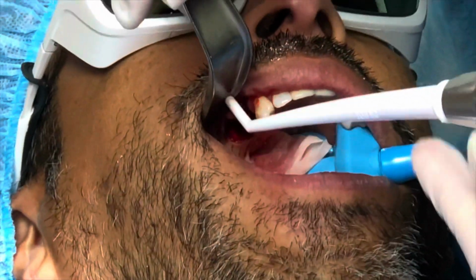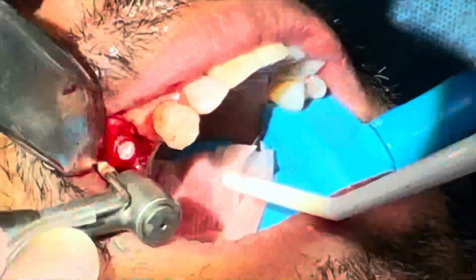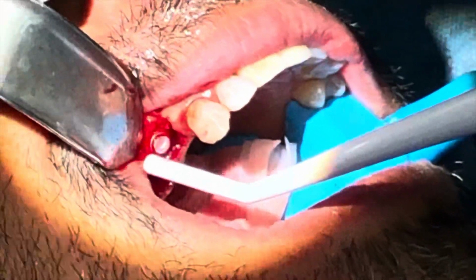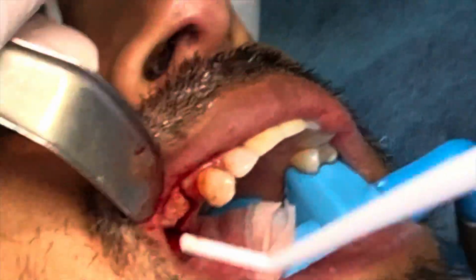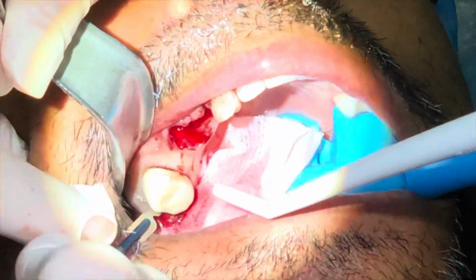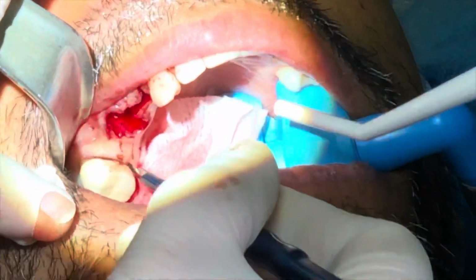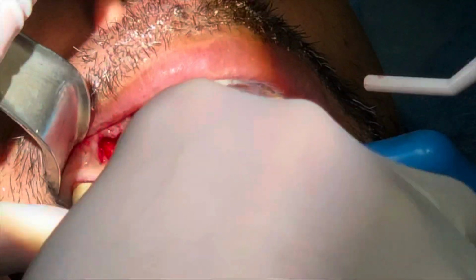We rinse the wound out with ozonated saline and we slowly insert the implant to a torque of 25 newton centimeter. Time to extract the last remaining tooth, which is tooth number 2. Same principles apply.